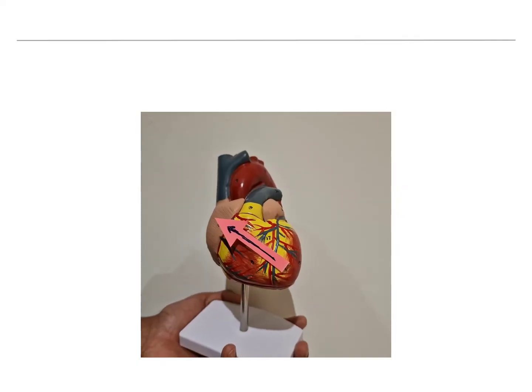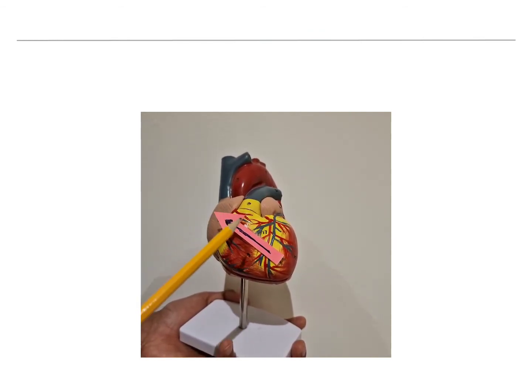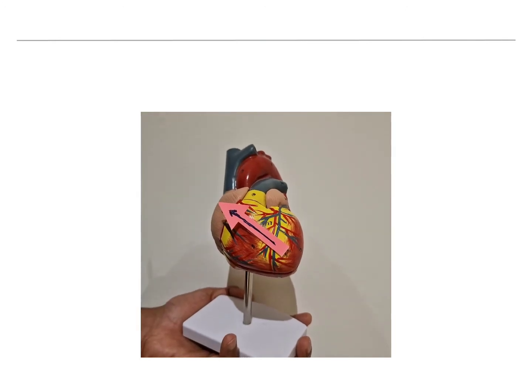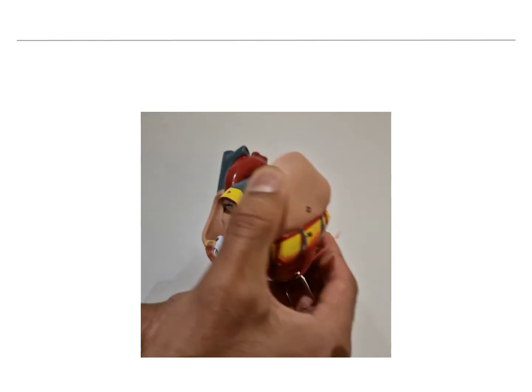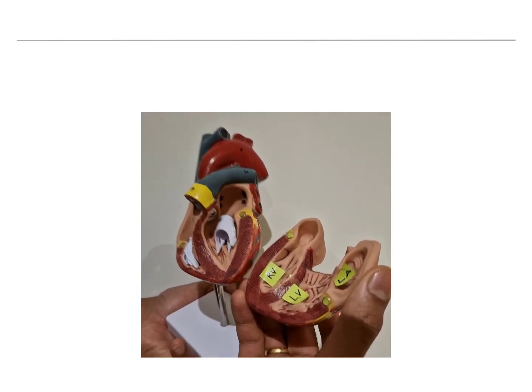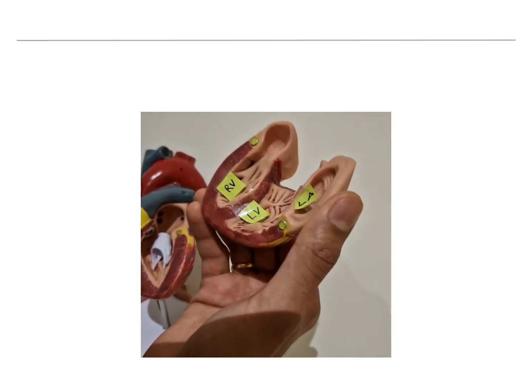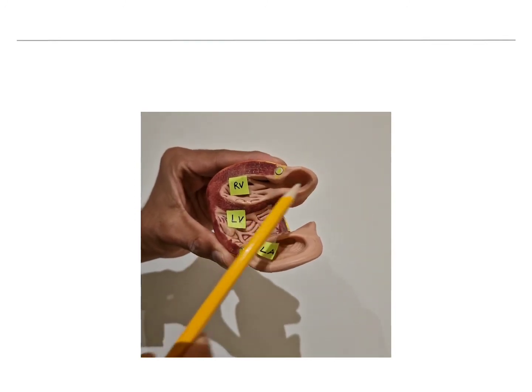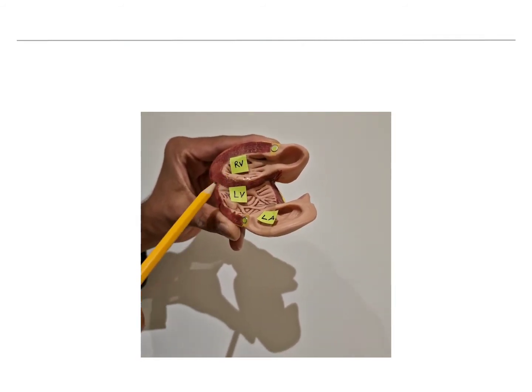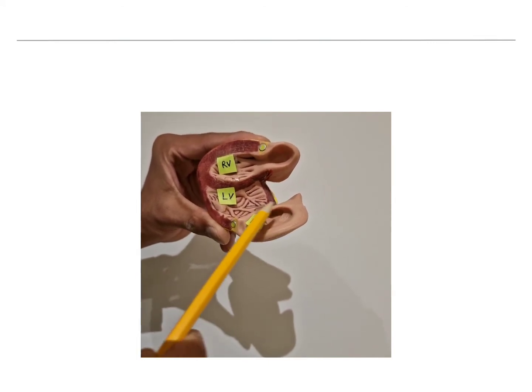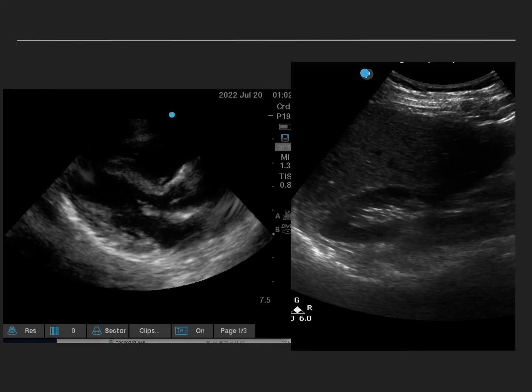In this model I'm demonstrating the parasternal long axis with the probe marker towards the patient's right shoulder. Taking a cross-section, on the monitor I can see the apex, right ventricle, left ventricle, left atrium, and the left ventricular outflow through the aorta. In a parasternal long axis example, we can identify the left atrium, mitral valve, left ventricle, outflow through the aorta, right ventricle, and interventricular septum.